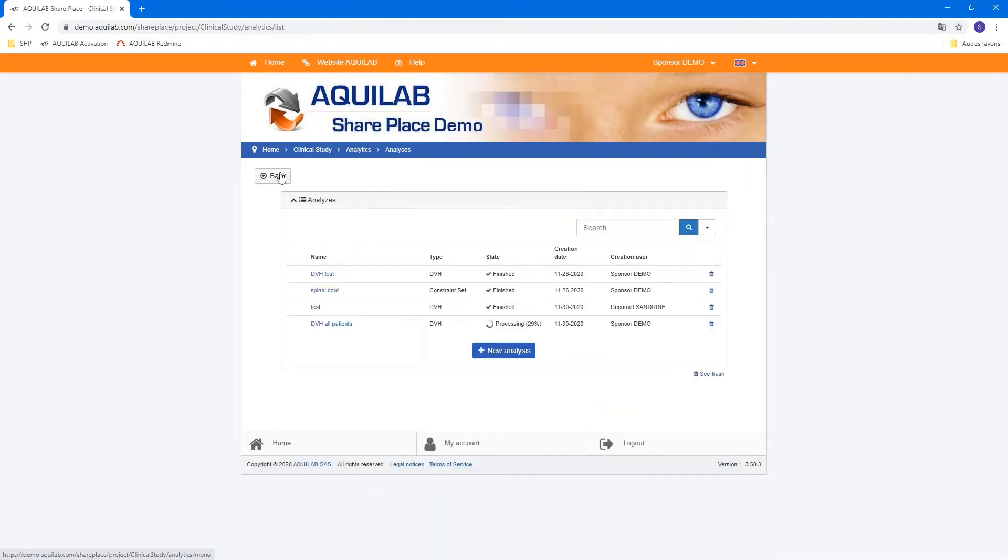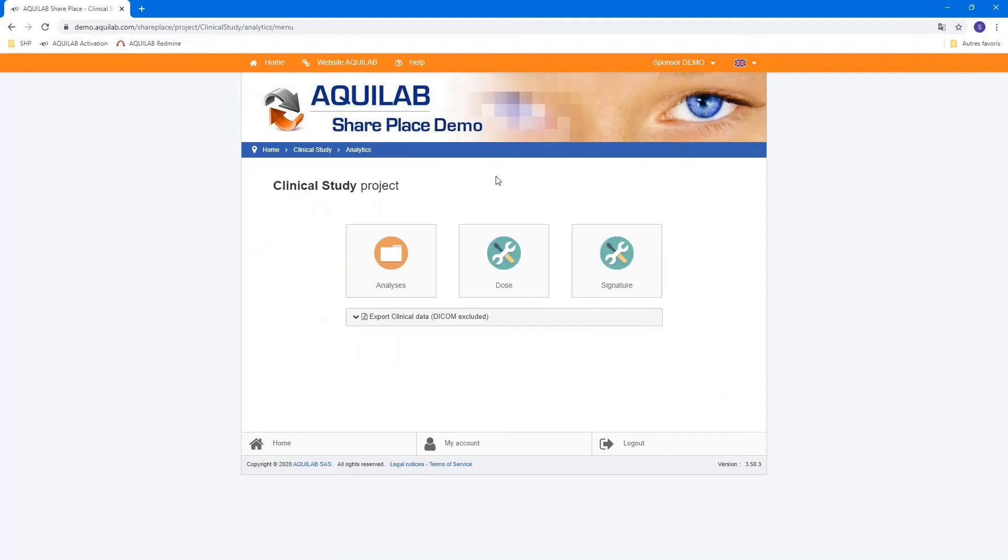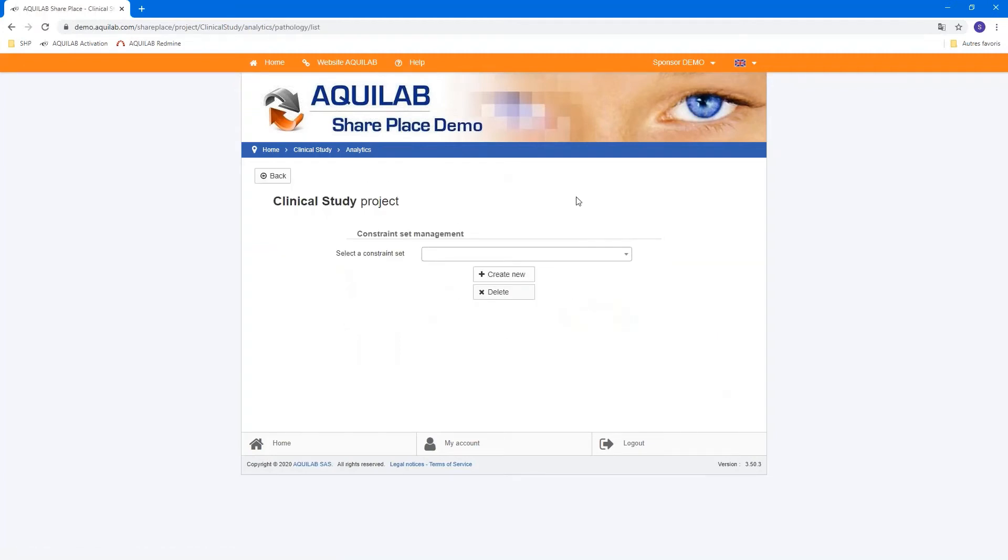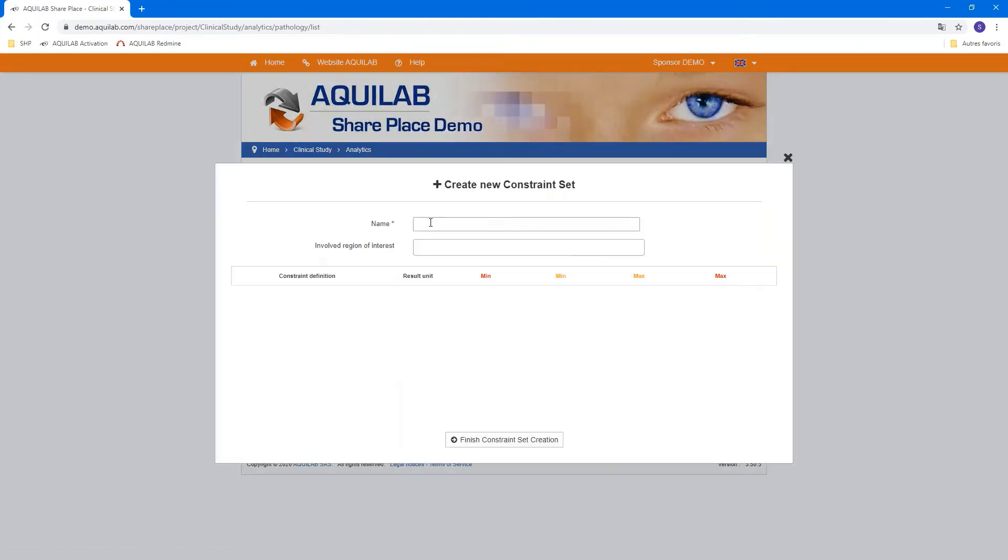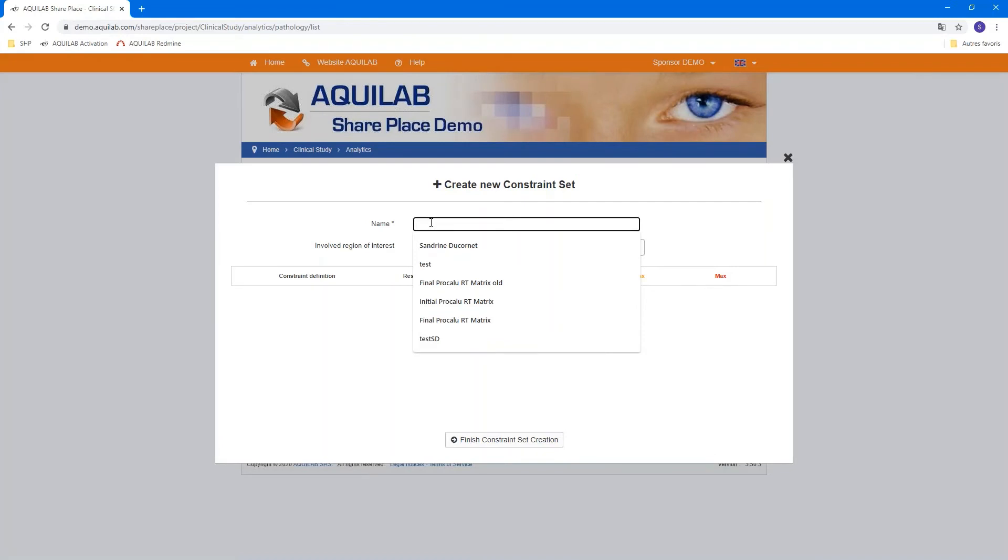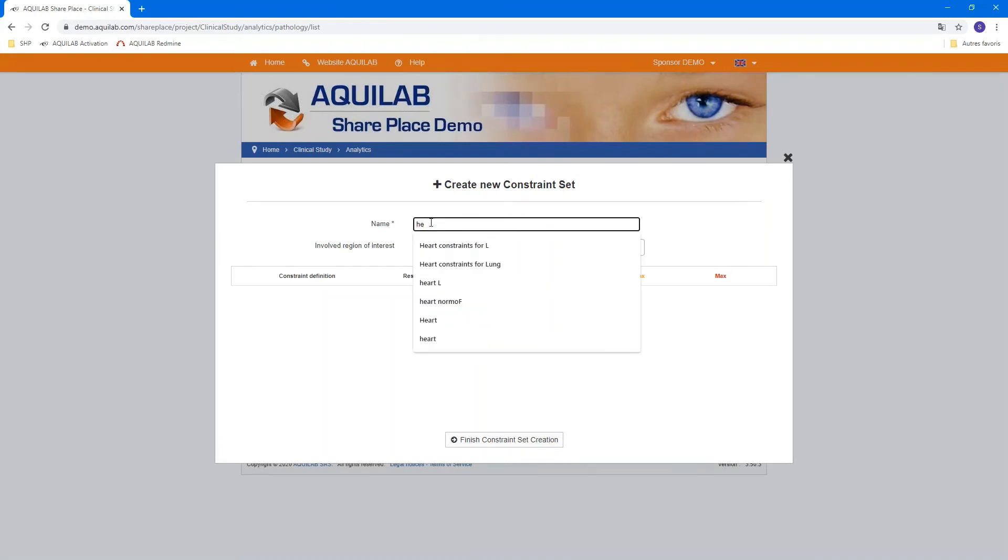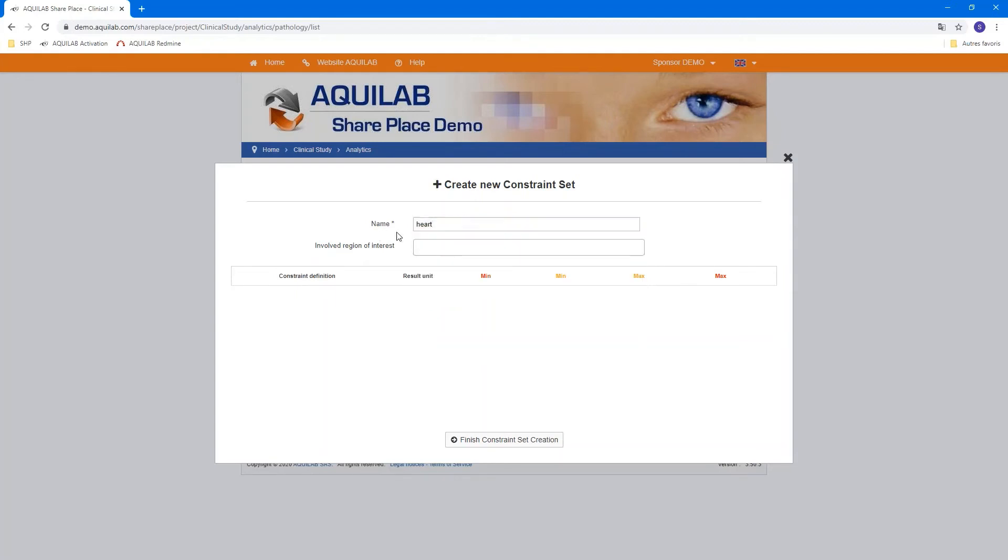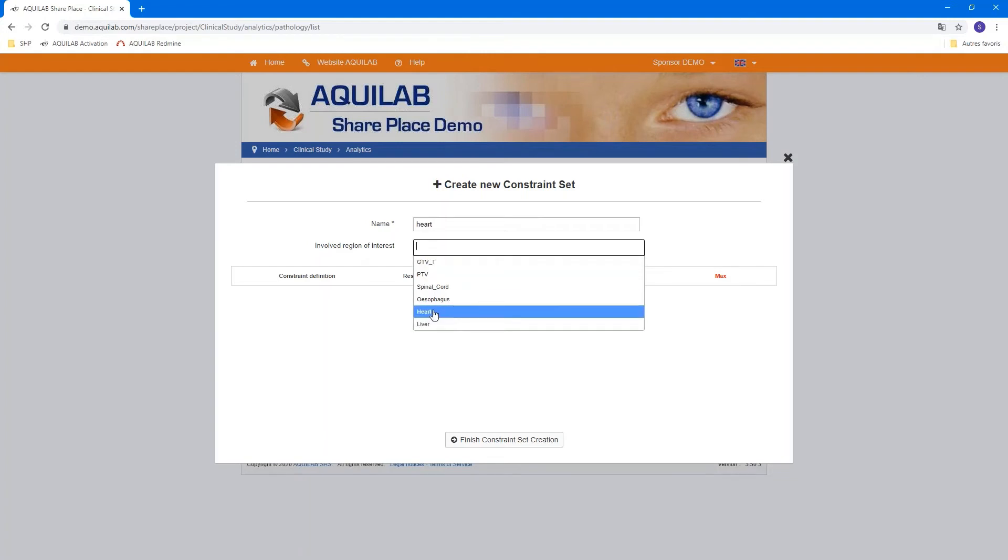Once the DVH test analyses are done, we can create a constraint set. We go to Dose. And we can create a new one. For example, in this demo, we can create the heart constraint.